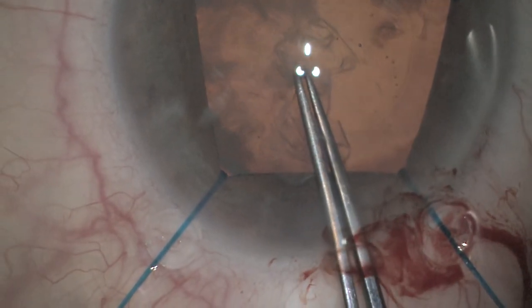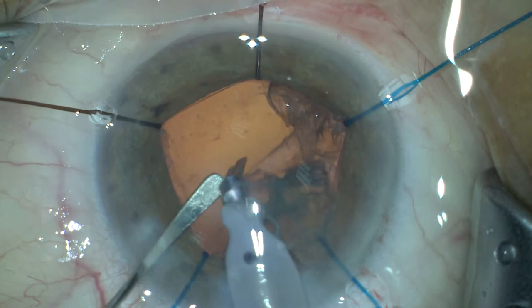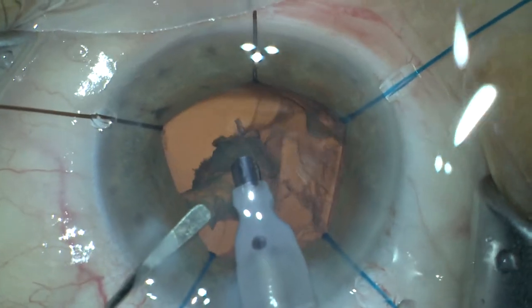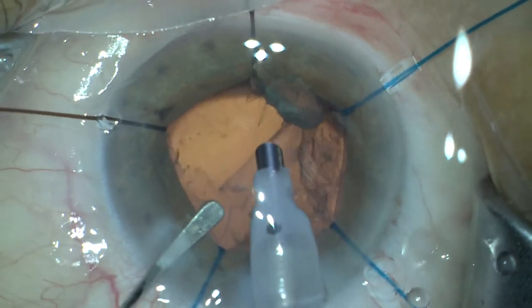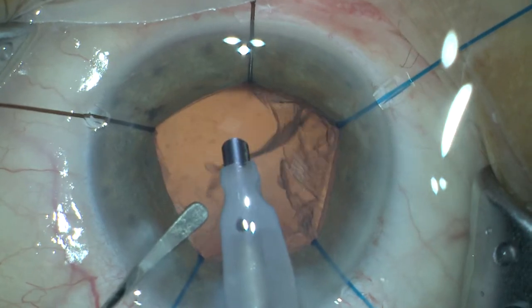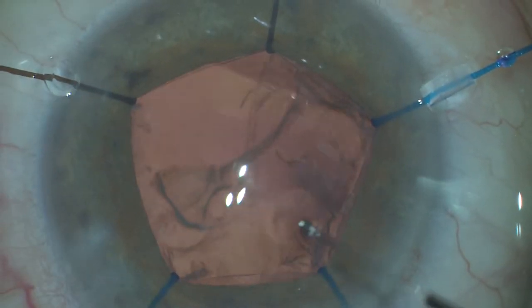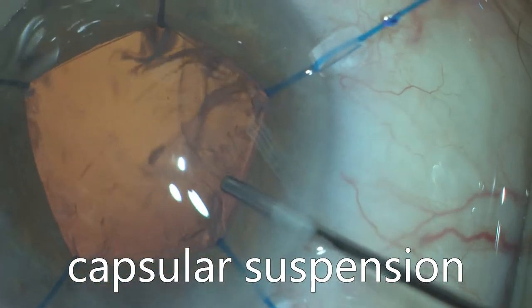With suspension of the capsular bag, this is the capsulorhexis now, and after that we suspend the capsular bag with five iris retractors — before any maneuvers of hydrodissection, rotation of the lens, phaco, and cortex aspiration.